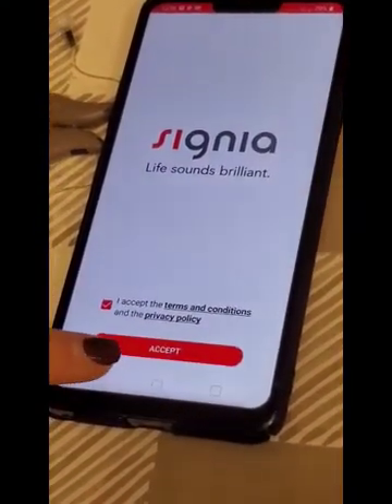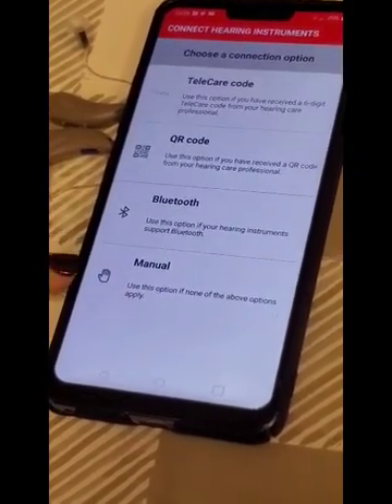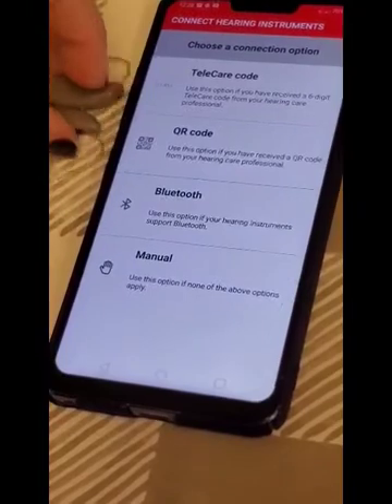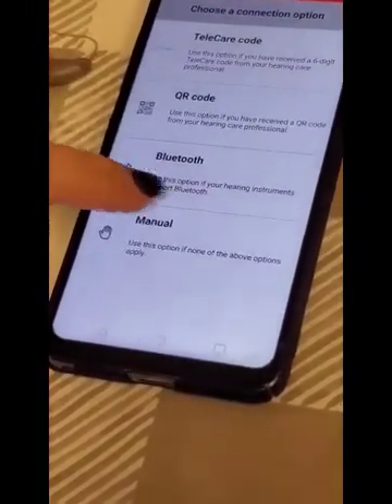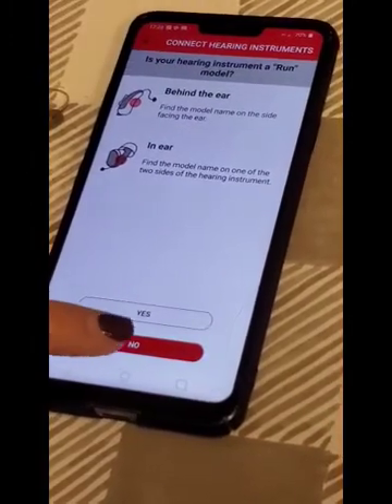I'm going to go ahead and accept their terms and conditions and the privacy policy. We're going to do a manual setup right now. Once you click on manual, it's going to ask if your hearing instrument is a Run model — go ahead and hit No.